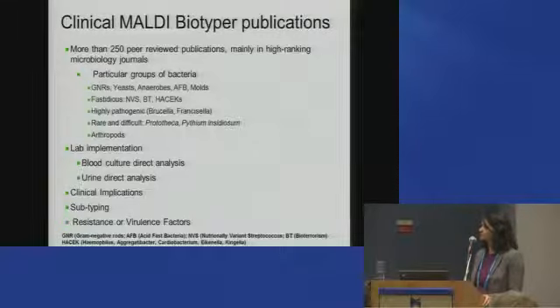So with regards to the MALDI publications, as alluded to by a previous speaker as well, there really is an explosion of papers coming out that are relevant to clinical microbiology in this particular arena. There are more than 250 peer-reviewed publications. That may not sound like a lot, but believe me, as compared to previous years, this is an area which is rapidly escalating.